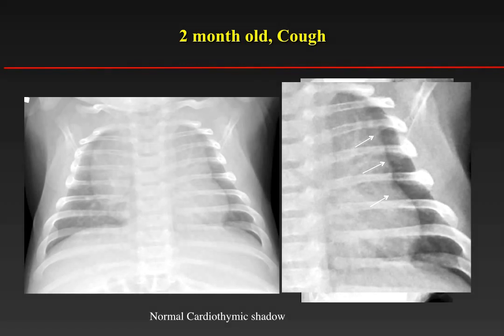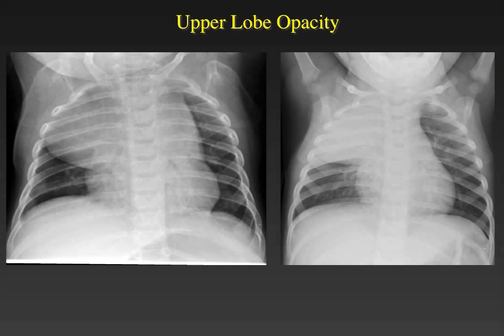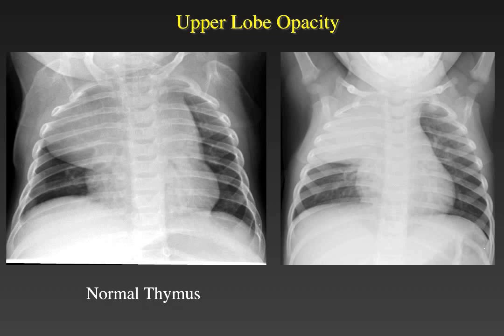I'll show four children with a right upper lobe opacity to illustrate how to tell the difference between a normal thymus and other pathology. In the first child, the thymus is well-defined, not displacing the trachea, and we can see through it to normal lung parenchyma — this is a normal thymus. In the second child, there is a right upper lobe density through which we cannot see lung, with a very well-defined minor fissure below. This is a child with pneumonia. Comparing them side by side, the differences in density are clear.